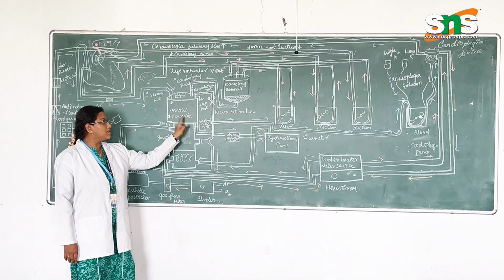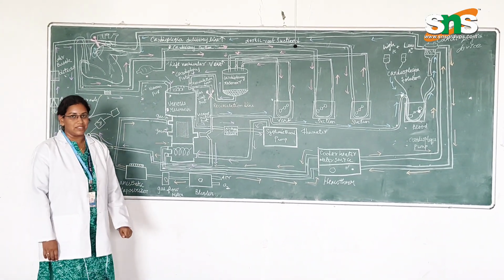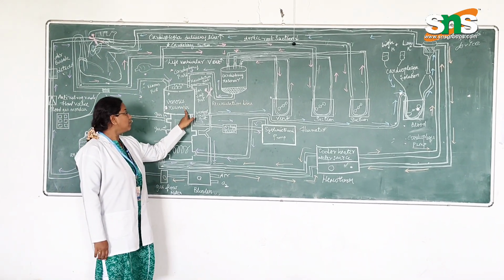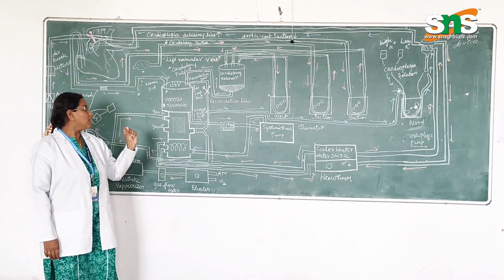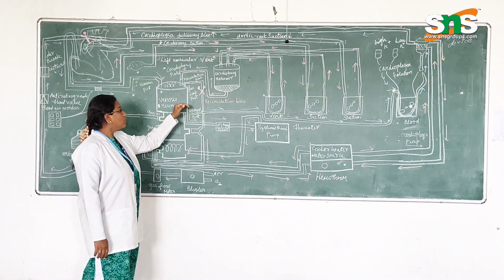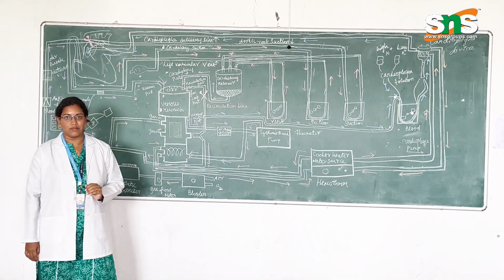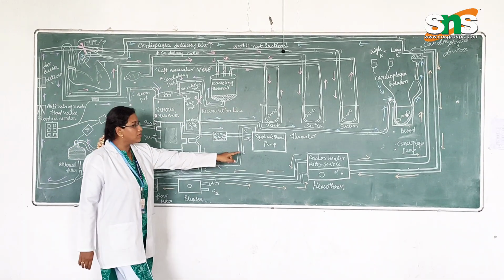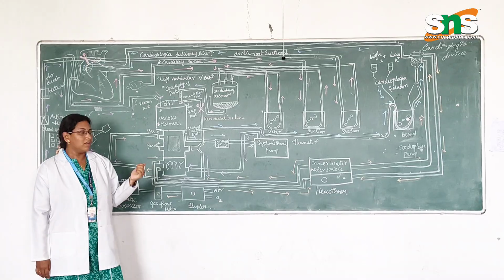Emptying of the venous reservoir can occur when there is a lack of blood from the SVC and IVC. So it is an important role of the perfusionist to monitor the reservoir level. The reservoir level will be maintained at almost 25% of cardiac output. When the reservoir level falls below 200 to 300 ml, the level sensor will automatically give an alarm. When the level sensor works, the perfusionist can reduce the pump flows and add a priming solution or blood if needed.